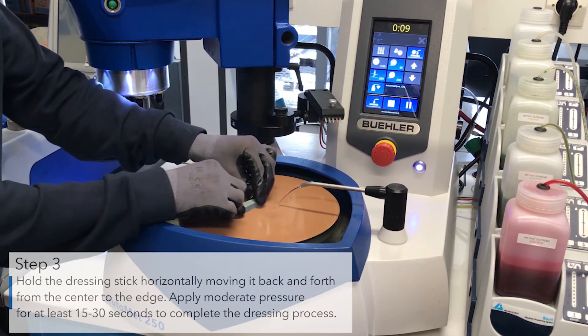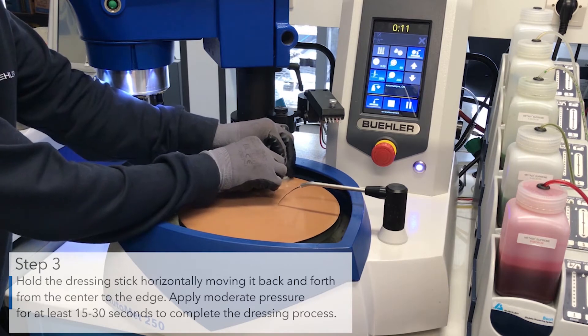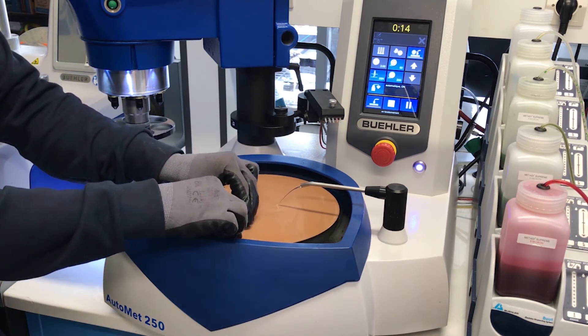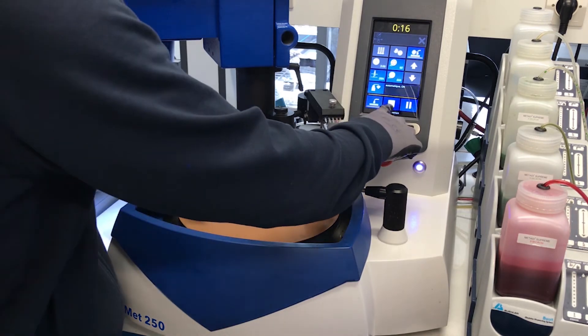Apply moderate pressure for at least 15 to 30 seconds to complete the dressing process. The DGD Terra disc is now properly dressed and ready to use.